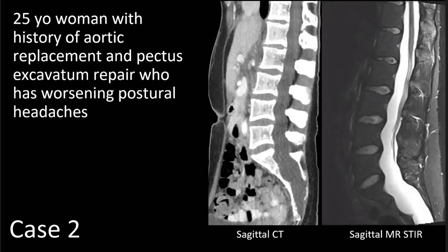Our next case is a 25-year-old woman with history of aortic replacement and pectus excavatum repair who has worsening postural headaches. On the sagittal CT image, we see the concave or scalloped margins of the posterior aspects of L1, as well as L3 through S1 vertebral bodies, as indicated by the black arrows. On the sagittal MR STIR image, we see widening of the dural sac, particularly at the level of the sacrum where the sac is wider than the width of the S1 vertebral body.